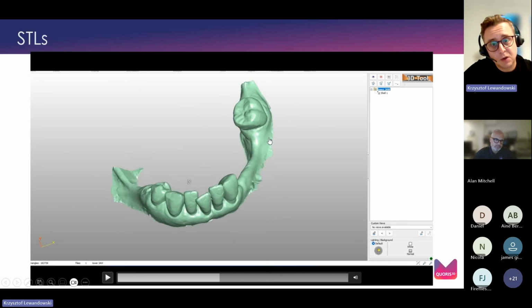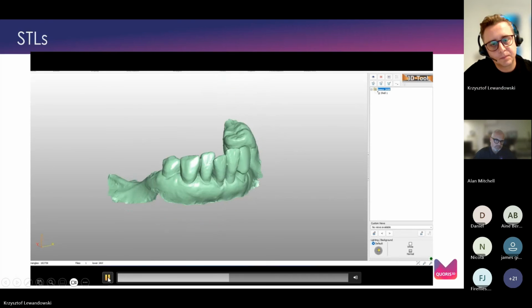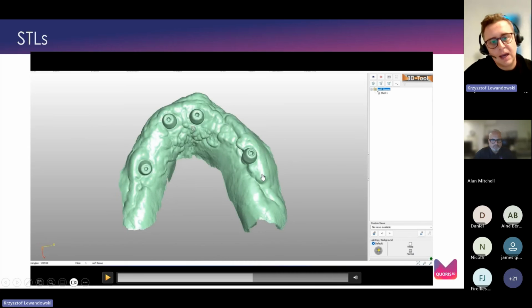We received a separate scan of the lower arch, which has been used for the design of the CHROME GuidedSMILE parts. We also received the upper gingiva record with the healing cups, and it's worth mentioning that those healing cups can be used as a reference point for stitching the optisplint against the soft tissue.